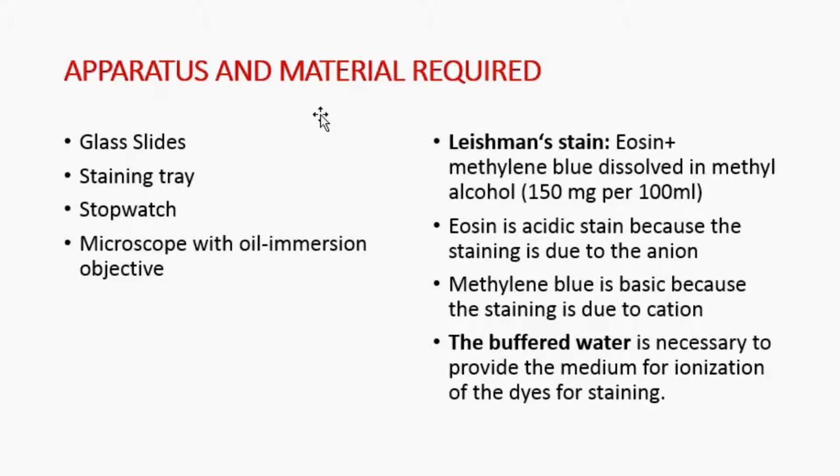The buffer water is also required in order to provide the ionization of the dyes for staining, because these stains, when they are prepared in alcohol, are not ionized, and when they interact with water, they get ionized and stain the nucleus and cytoplasm.